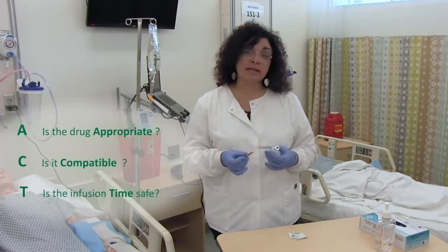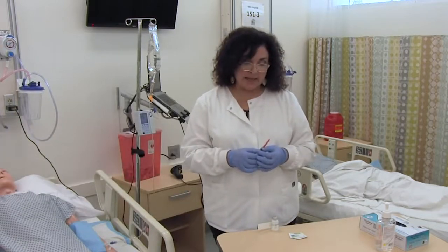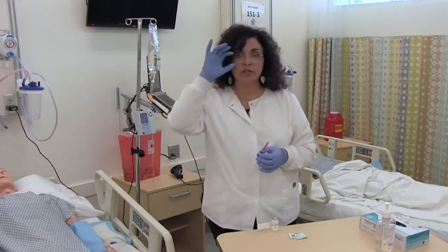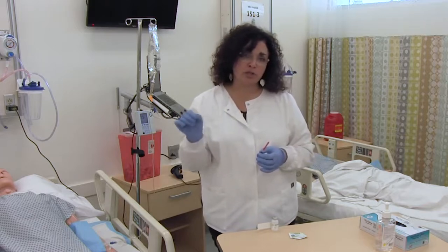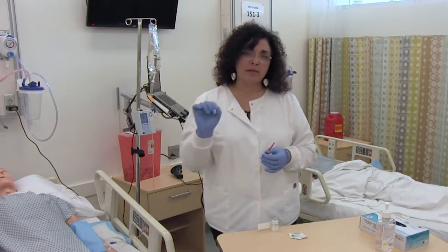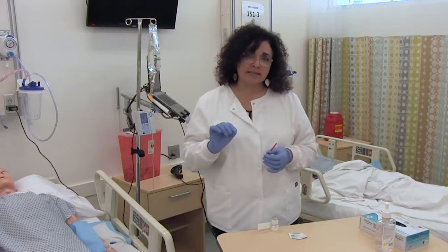Now, the other thing I like to do before I get started is I like to have a game plan, meaning that when I'm pushing an IV push medication, it is not a continuous sustained push. It really amounts to a series of small pushes or incremental pushes where I'm giving a little bit of the medication approximately every 15 seconds.